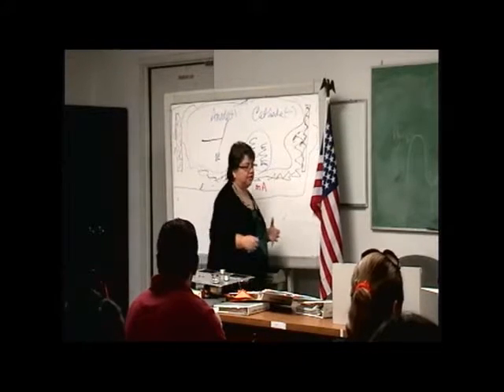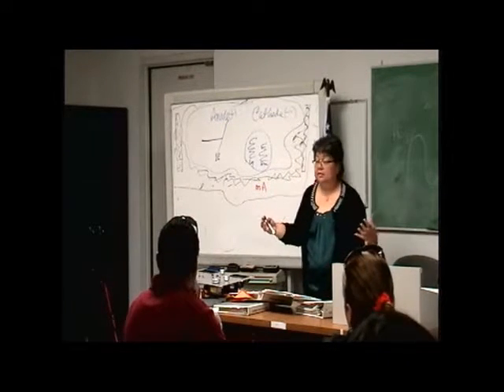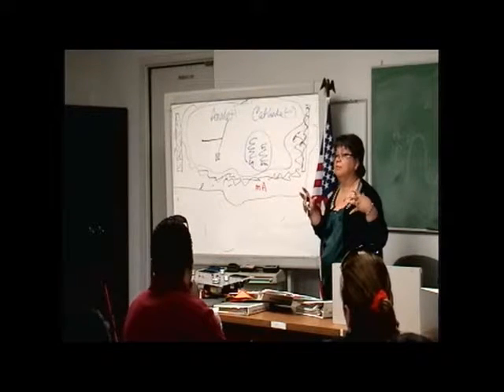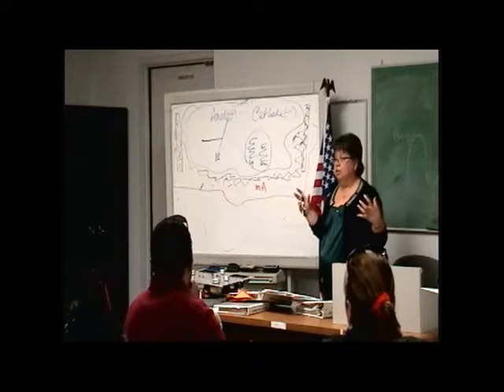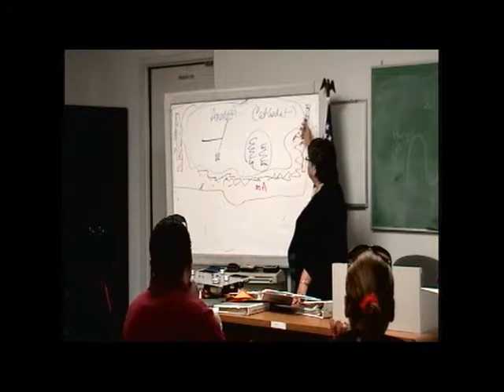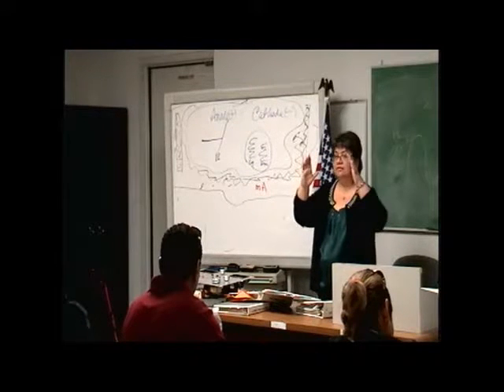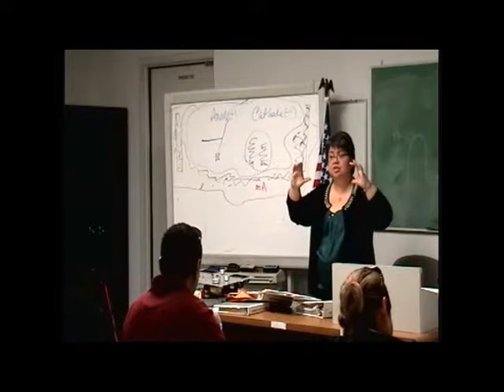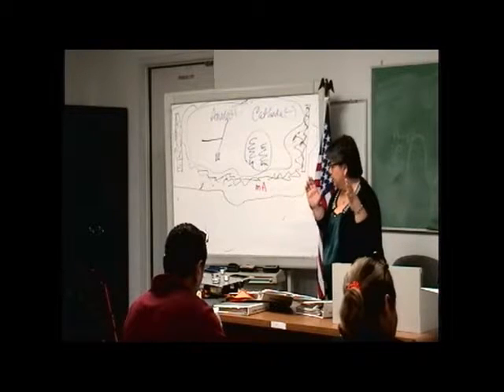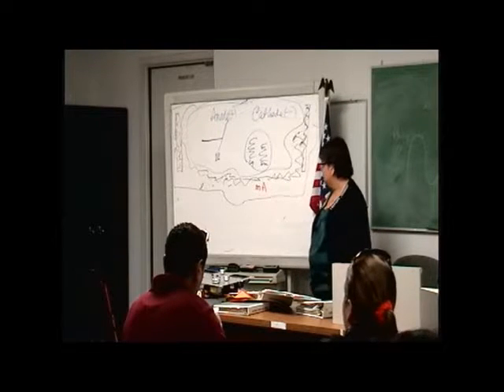What happens when things get very, very hot? What do solid things eventually do, or anything? They expand. If I have this encased in metal with screws and everything, and this gets really hot, what's bound to happen? It could crack and break or leak all that oil. So inside the X-ray tubes, we have something called bellows. These bellows have the ability to move a little bit, so they have a little give to allow for the expansion during heating or cooling and relaxing, so that you don't put extra pressure against the metal housing around your X-ray tube.